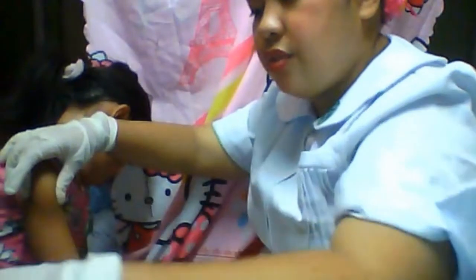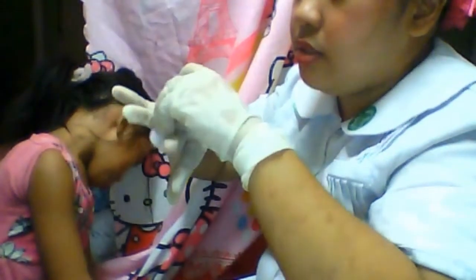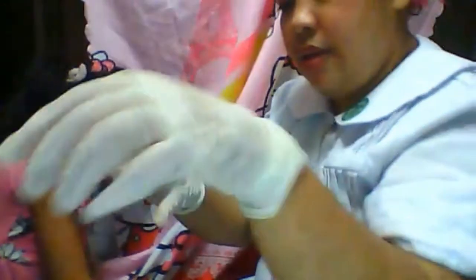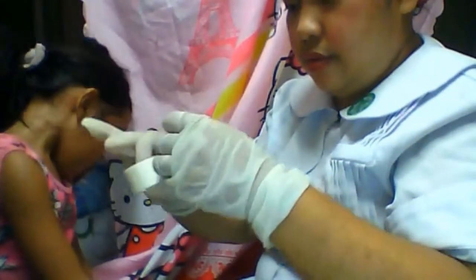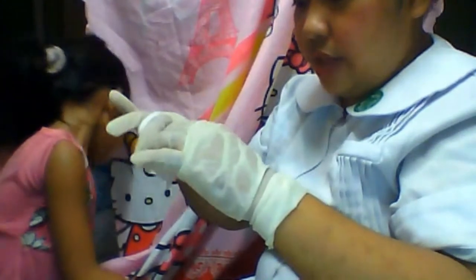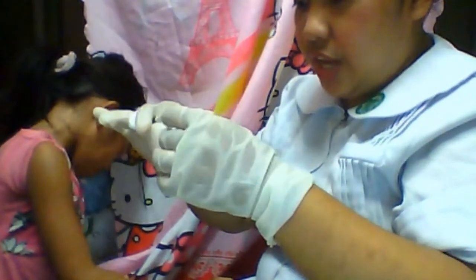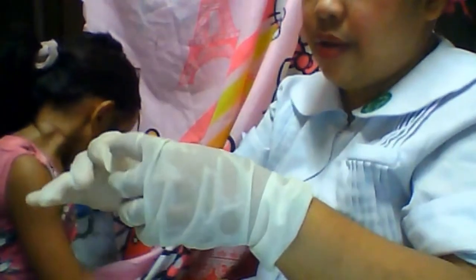Before that, you can get your dry cotton balls and put them here, and then your micropore. This would be used after injecting, so we want to cover the punctured area.